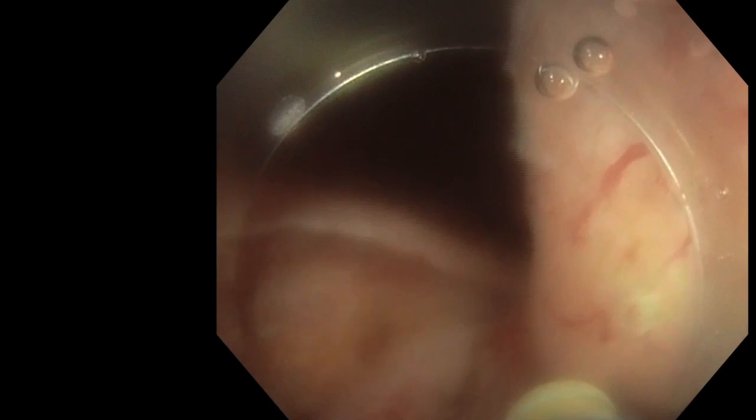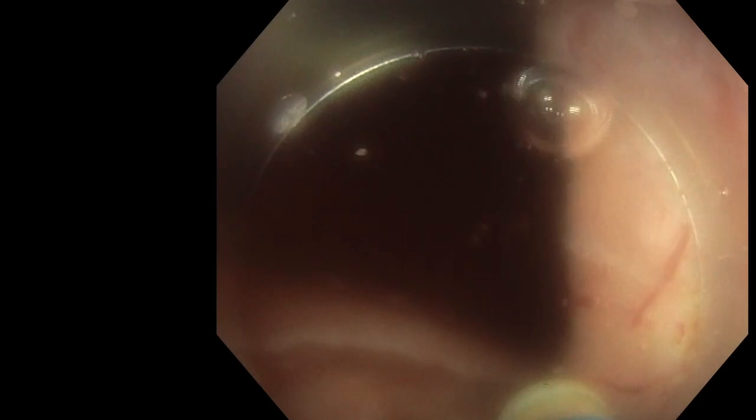Also with conventional light, sometimes you don't see it. It will not completely change things and make the bleeding point really visible if it's in the blood lake, but sometimes the window to see it is a little longer thanks to RDI, making it possible to clearly see where it comes from.